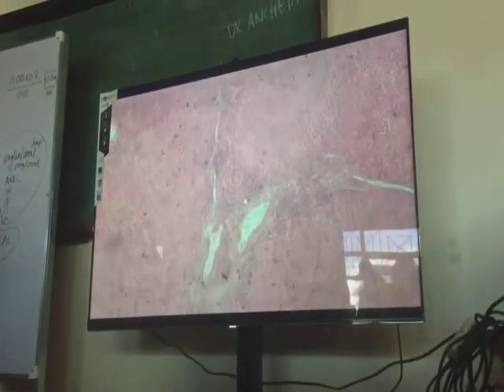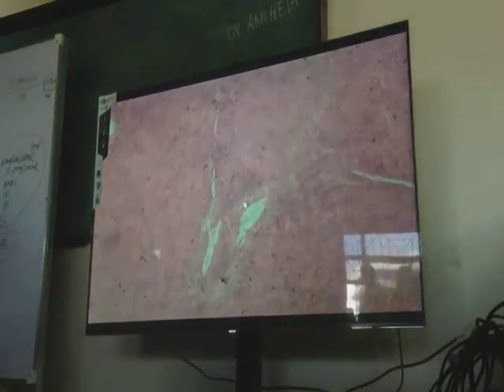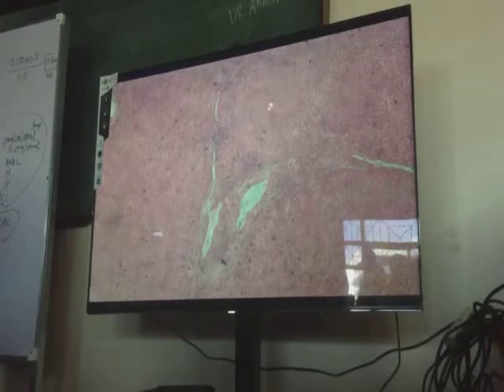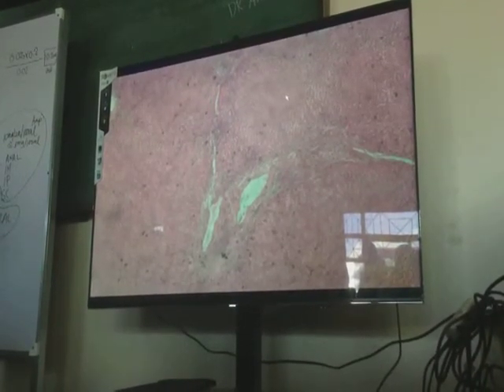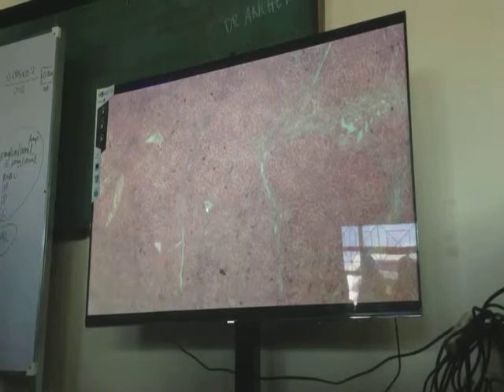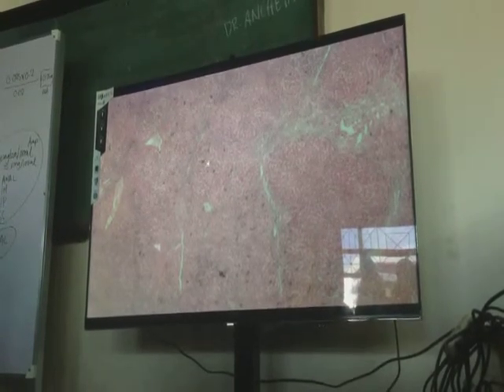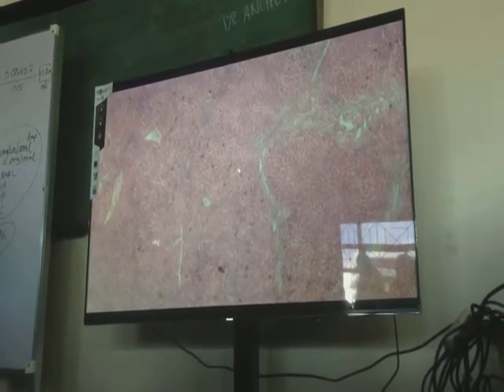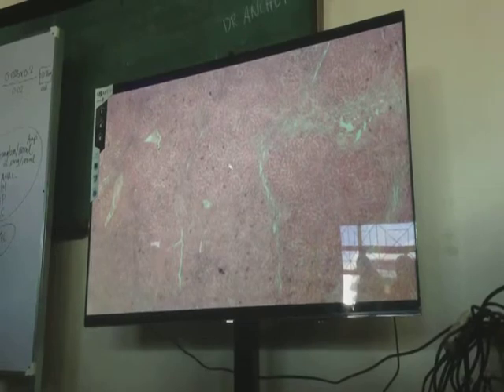At that magnification, what should be our diagnosis? Okay, let us examine the components of the liver first. Is the lobule of hepatocytes abnormal? Are the lobules of hepatocytes abnormal? How will you call the vessel pointed? Central vein. So you have a distinct central vein and then the lobules of hepatocytes. So relatively, the lobules are normal.